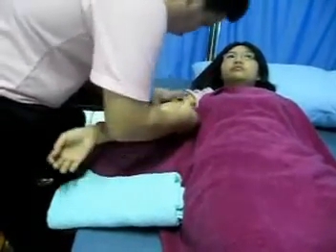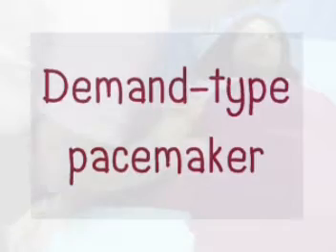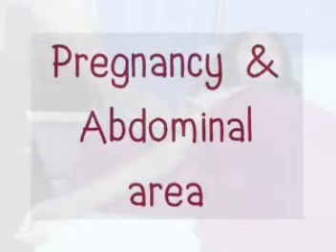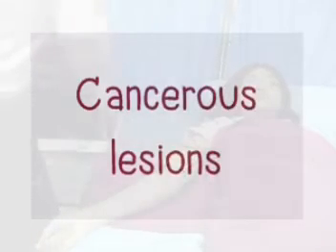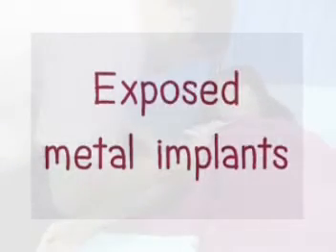Contraindications and precautions: area of impaired sensitivity, severe obesity, epilepsy, cardiac disability, demand type pacemaker, pregnancy in the abdominal area, menstruation in the abdominal area, cancerous lesions, signs of infection, exposed metal implant.